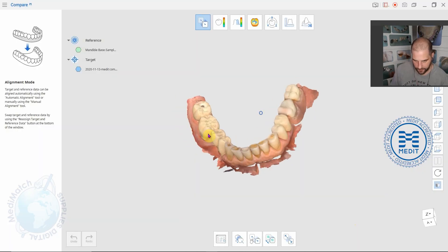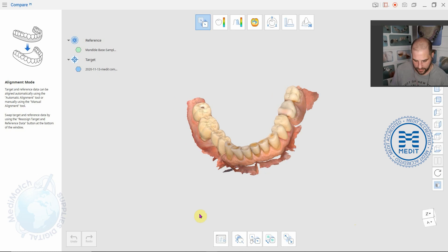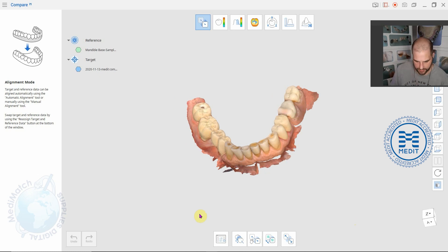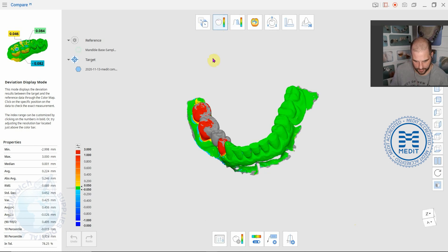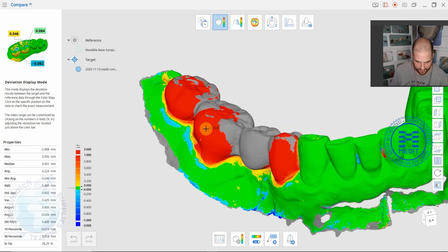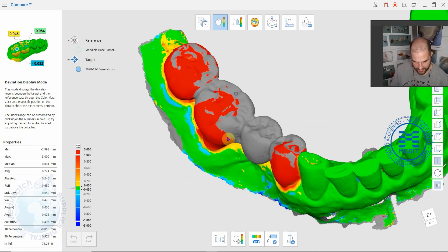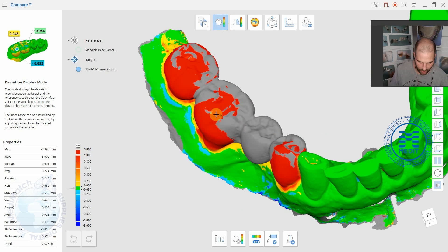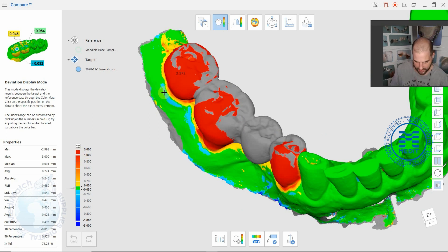Now the reference and the target has been switched. If we now go back to the deviation display mode we can now see that based on the other way around there's way more than 3 mm of material here compared to the original prepped scan.